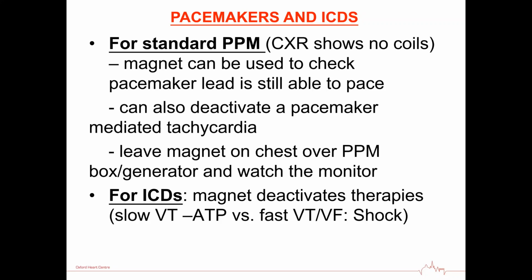When you remove the magnet, it'll go back. Generally, if you leave the magnet on there for 10 to 20 seconds, it will completely terminate the pacemaker-mediated tachycardia, but you need to use drugs like beta blockers as well. In the case of an ICD, what it does is deactivate the therapies.